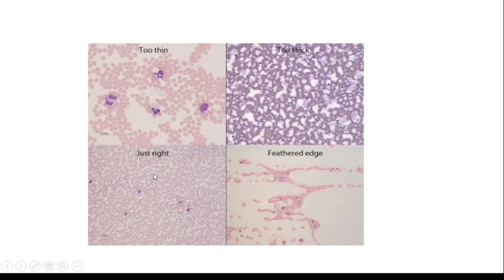In the lower left corner, the film is suitable for counting. Here, the red blood cells are in monolayer. Lastly, the lower right corner, feathered edge. We don't use this area to count cells.